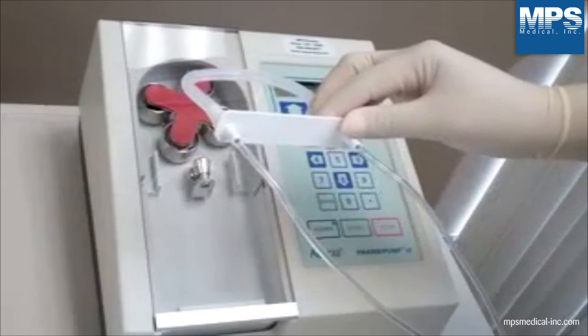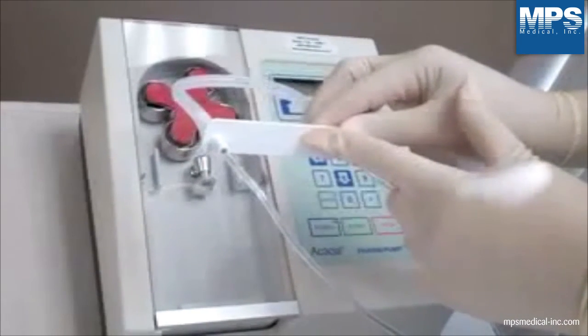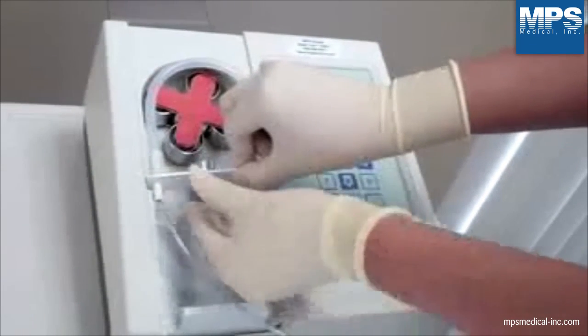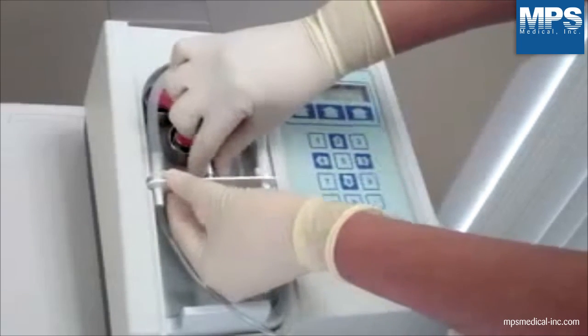Loading tubing. The white bar connector has an arrow on it. Point the arrow down facing the pump, then slide it into the side grooves of the pump. Pull the spring clip knob up and push the bar connector down as far as possible.